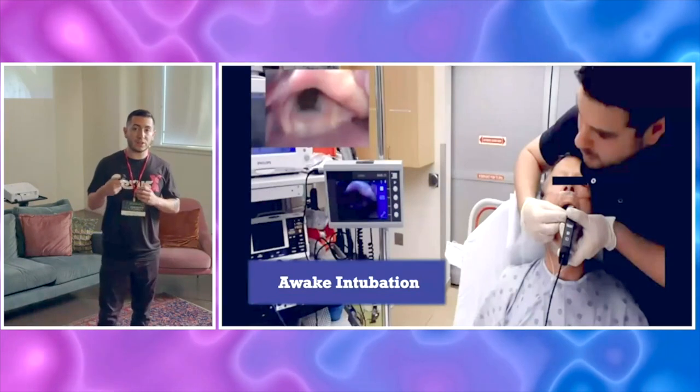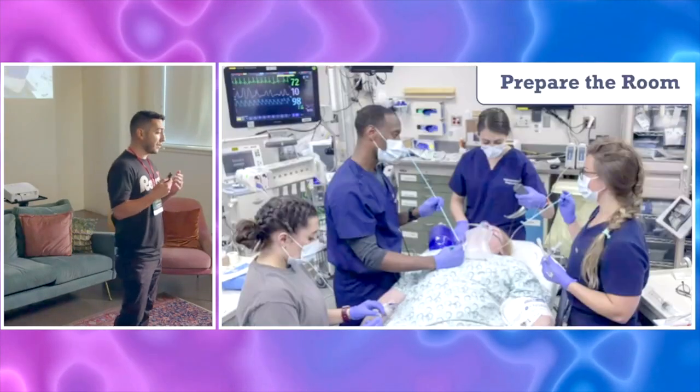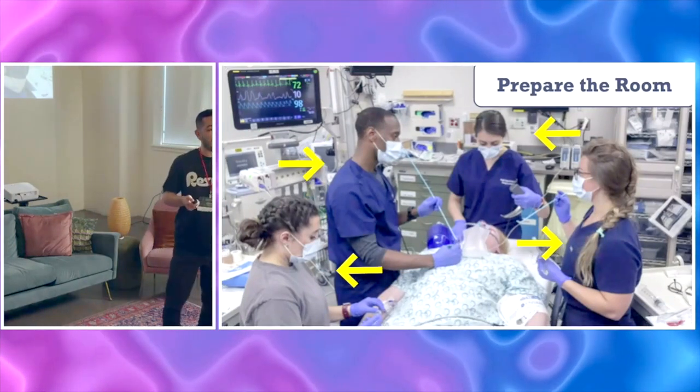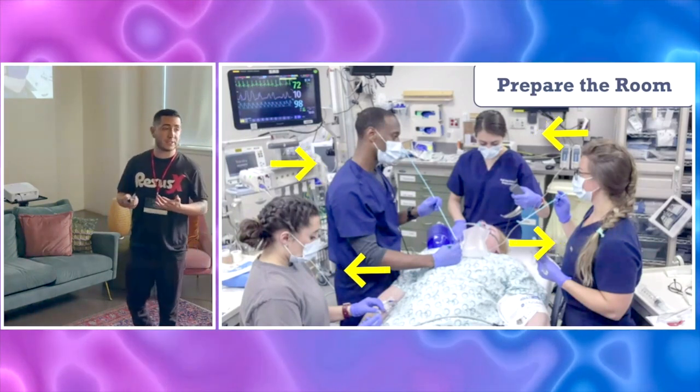All right, so now let's move on and talk about how to actually perform the procedure. So the first thing you want to do is you want to prepare the room, right? You want to have all of the equipment, all of the staff that you need at the bedside in order to maximize your chances of success.